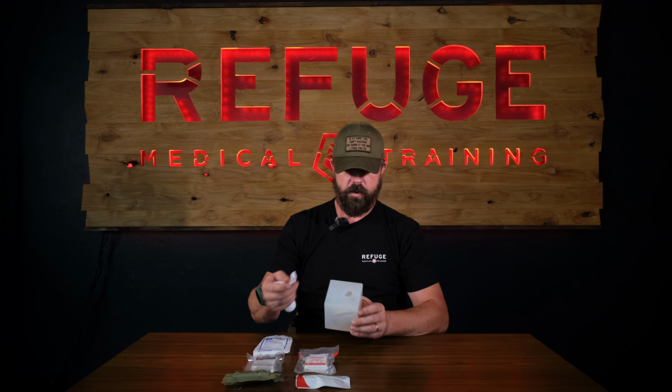So this can be very good and useful for when you are packing a wound. We have our wonderful focus wound cube here. It has a variety of different wounds on here. I'm going to focus on this one because it has a small entry and then a larger cavity inside of that, right? So this might be easier to pack into a wound that has a small entrance wound or a small exterior. Now you're always kind of going to tear the exterior for any kind of gunshot wound or anything like that. But maybe this is a knife wound that doesn't have a large entrance wound and you need something thinner to more easily press into that.